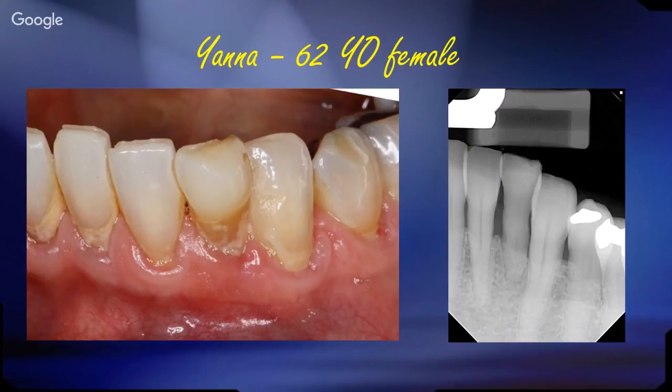And we knew that this lower tooth, at some point, her primary tooth here would exfoliate as well. And the minute it started getting loose, she called up and wanted to have an implant done, because the implant on the upper had gone so well 15 years ago, and it's still there. It's still doing very well. Still looks good aesthetically. So she came in, and of course, we're going to go ahead now and plan to place an implant there.